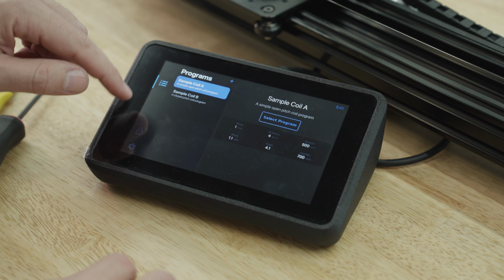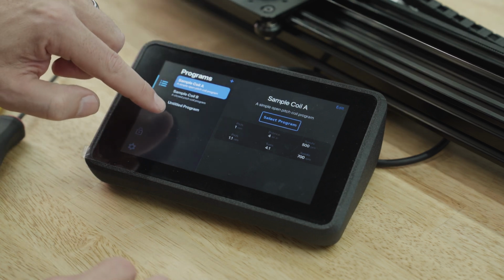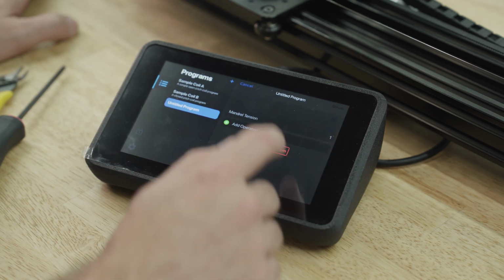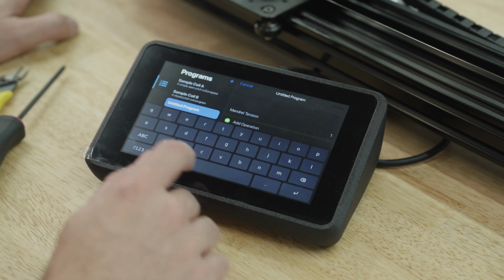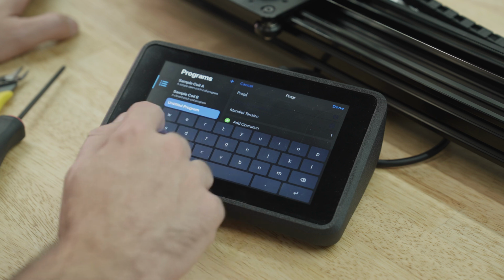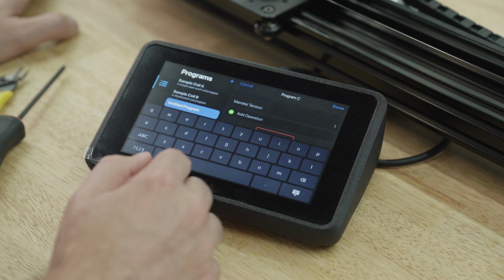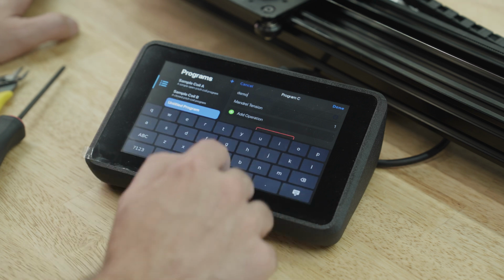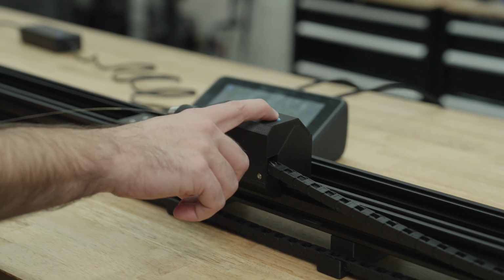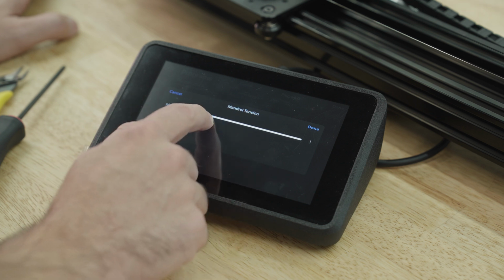There's 2 sample programs, but I'm going to add and edit a new one. Just press the plus sign to create a new program. Here it is, Untitled Program. Press Edit to change the name. We'll set the name to Program C. You can add a detailed description if you want. And you can even adjust the mandrel tension by program. Since this is a smaller mandrel, we'll leave that at 1.